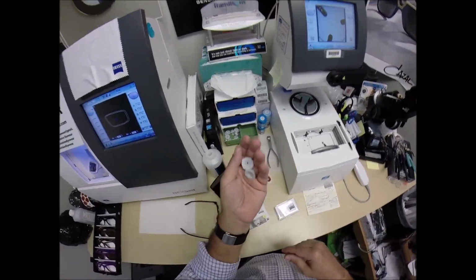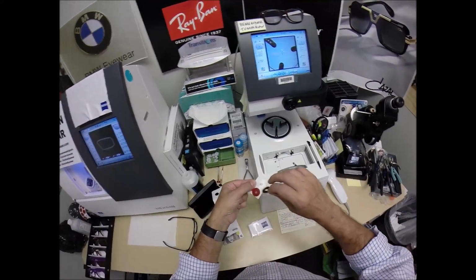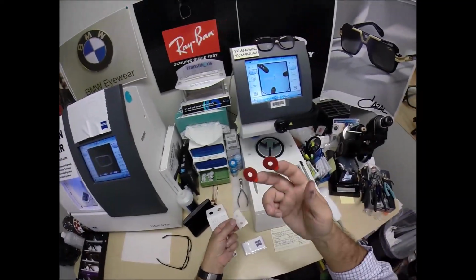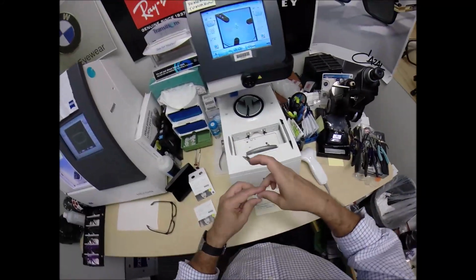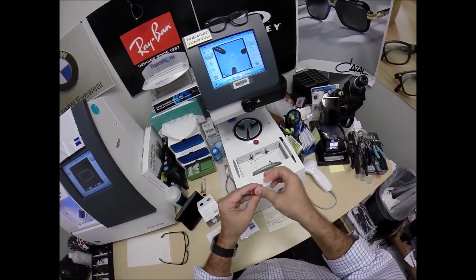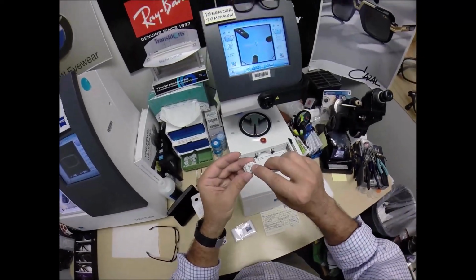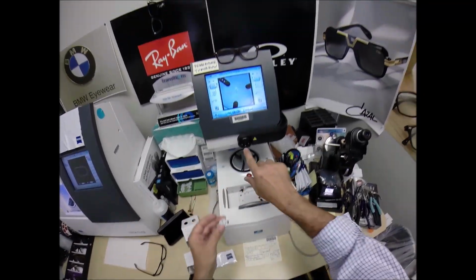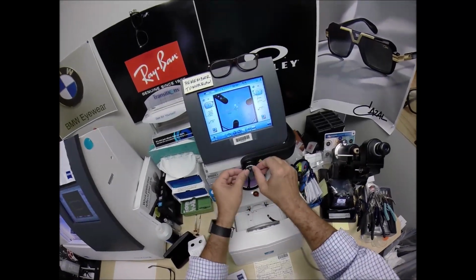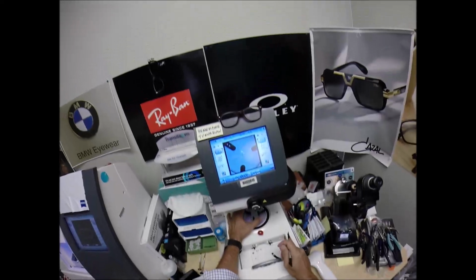This is a block, or as I like to call it, Jenny from the block. I need to attach this to your lens while it is cutting. So I need 2 double-sided adhesive stickers, of which I've got 2 here. Place this on the first one. Do the same thing now for the second one. I'm going to pull the paper away to make the black side sticky. On the back, that silver button is a magnet. It's going to do its job twice. The first time it's going to attach itself to another magnet there. Oops, it's still stuck to me. Magnet there in the arm.